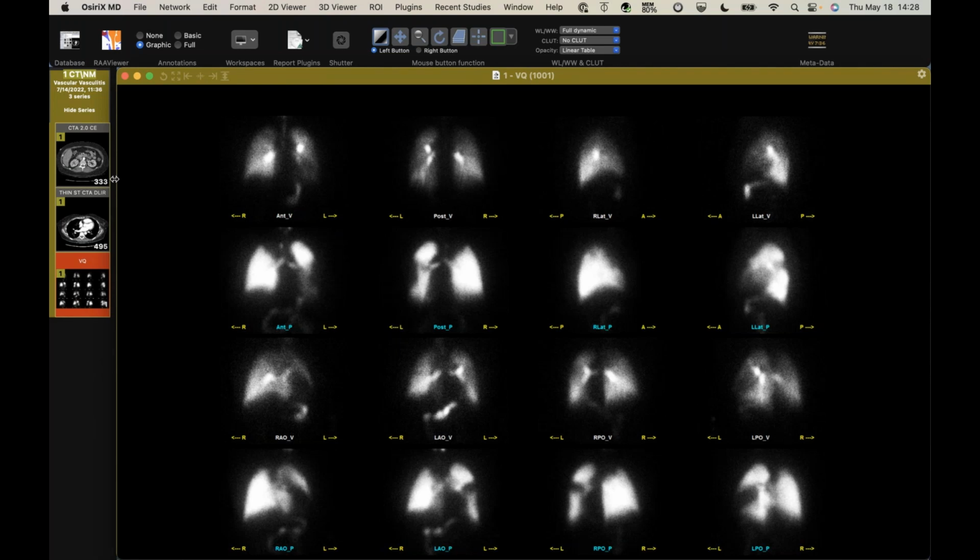So this patient, large vessel vasculitis in a 50-something-year-old, you would think of giant cell, but this is actually Takayasu. This is a long-standing process. I don't have more ancient imaging, but usually it's diagnosed before the age of 30. But I've seen some older patients with it. It's just kind of because it's a chronic disease.